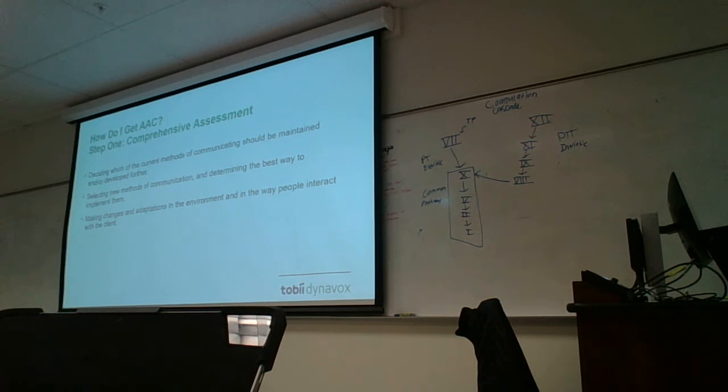If a family or an SLP just wants to do a trial on their own, they do have the option to go through the rental process, so there are costs associated with that. But you can put up to 4 weeks of that rental towards the purchase of a device. So it depends on what the funding sources are and what the family and SLP feel comfortable with. A lot of times you go into an evaluation and it's obvious that they need some sort of speech generating device. It's just a matter of starting the process and picking the correct one.